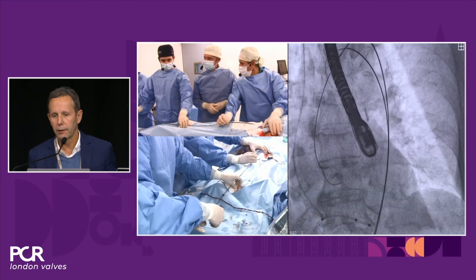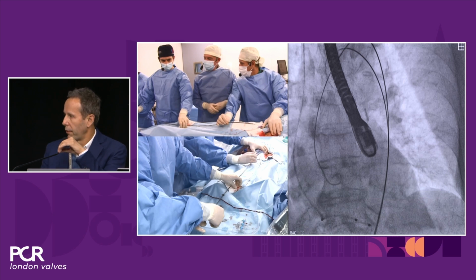Yeah, just because contrast is not the only reason why the patient deteriorates renal function after TAVI. Hypotension and bleeding, and there are many factors that can contribute to that. But anyway, we know that using less contrast is beneficial for these patients. Another point that is maybe important in this situation is that these patients with renal failure present with very calcified valves, and then the combination of reducing contrast and using cerebral protection makes a lot of sense in this situation.